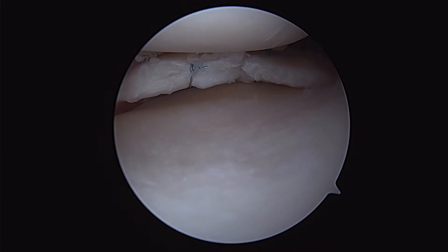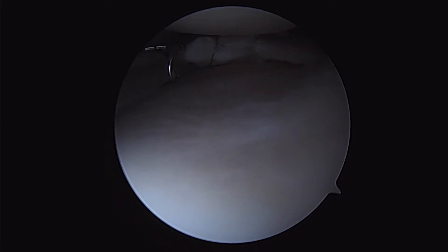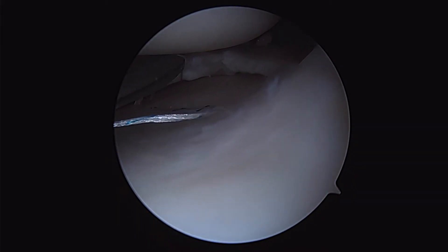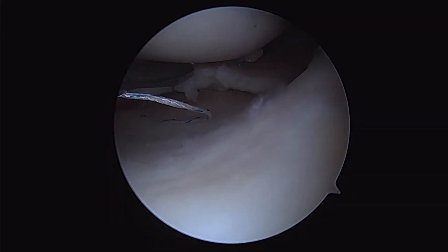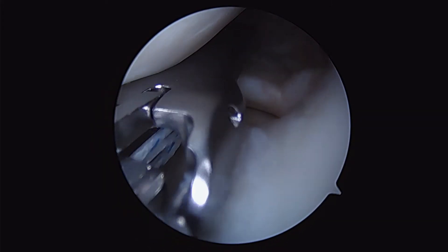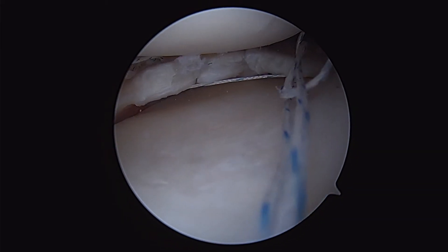We've got a nice rip-stop in the back, closing down the back part of our radial split, and we're going to pass another rip-stop across the front. As you can see here, I'm using this suture just to the right of my jaws as a rip-stop, then we'll pass over and pass on the other side of the radial split and we'll close down this radial split even more. There's our second suture — you can see our horizontal suture going across — and we'll tie this.